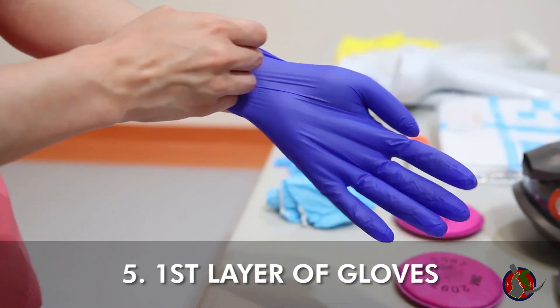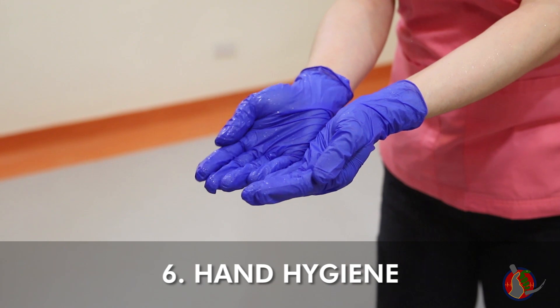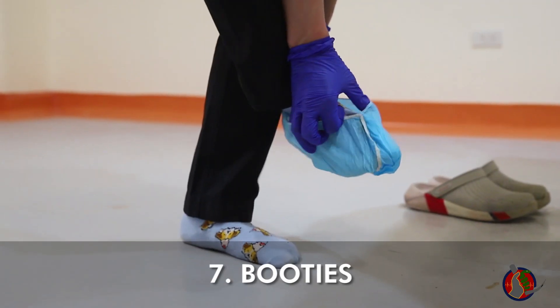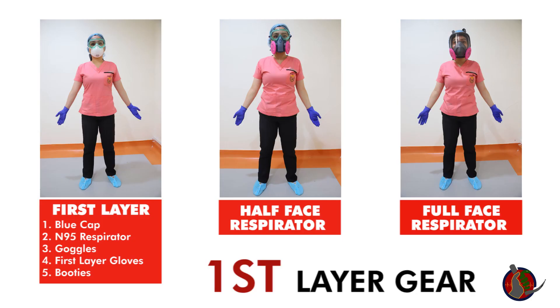Put on the first layer of gloves and pull gloves as far up into the forearm. Do hand hygiene. Put on blue booties over socks. Do hand hygiene. You have now donned your first layer gear.